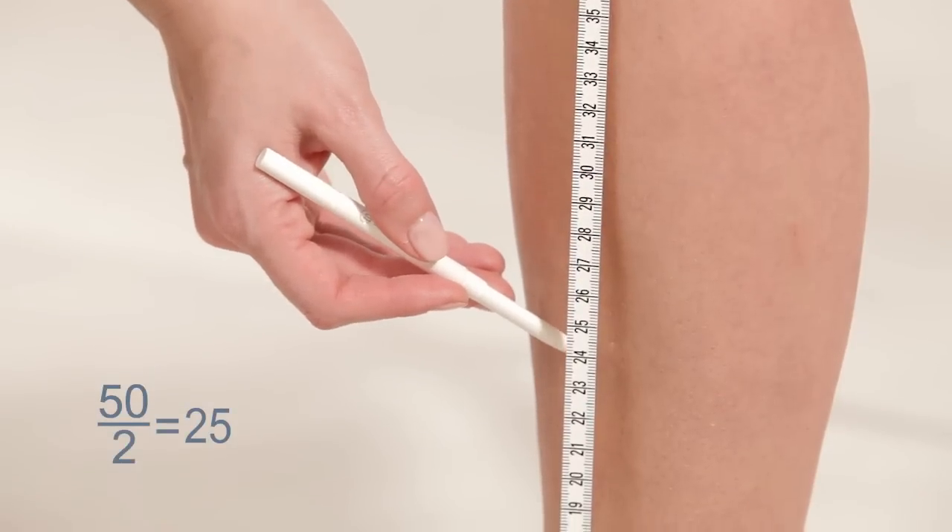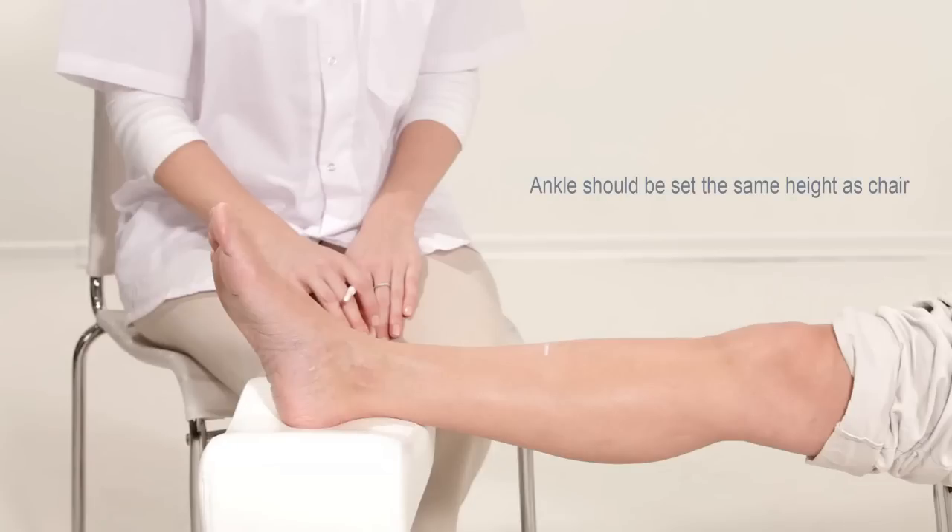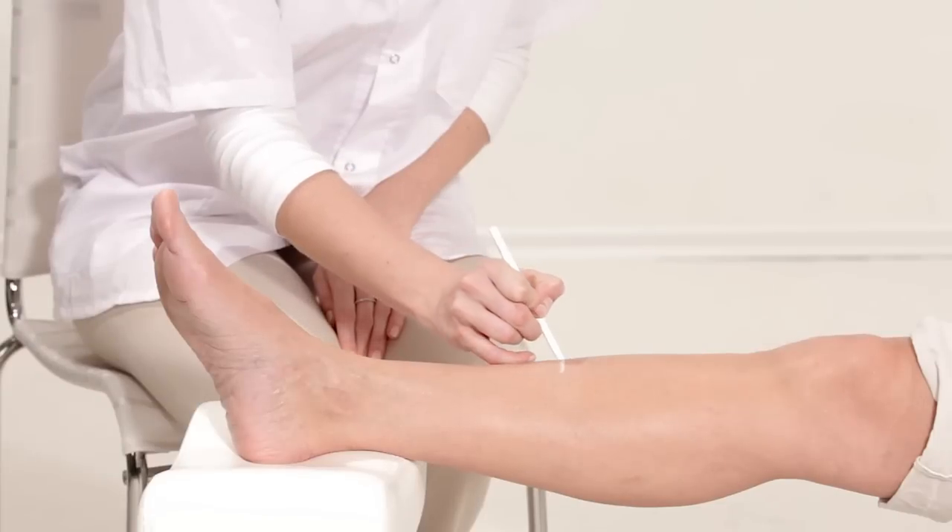Mark the halfway point by drawing a line on the anterior surface of the leg, then place the ankle on the leg rest, which should be set at the same height as the subject's chair. Extend the line across the anterior surface of the tibia.